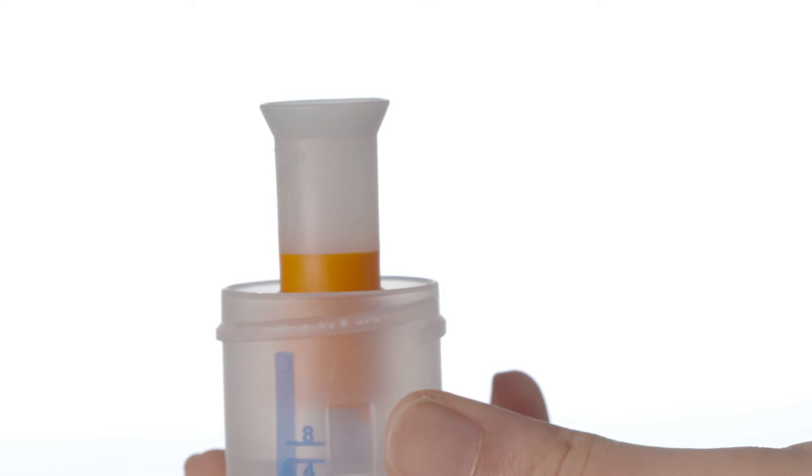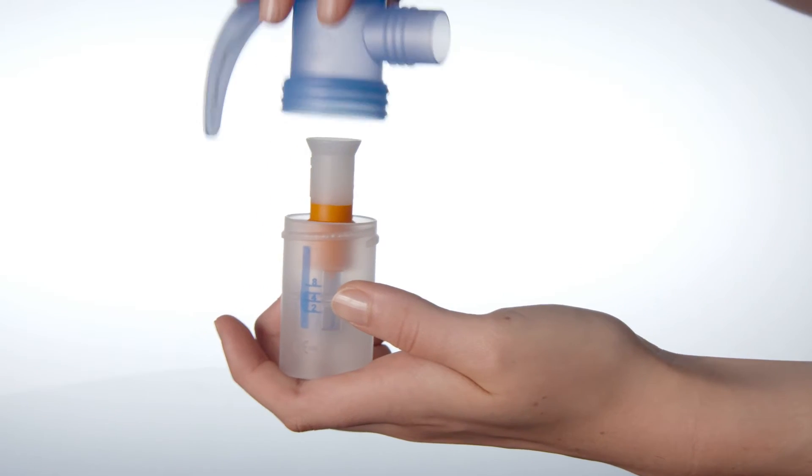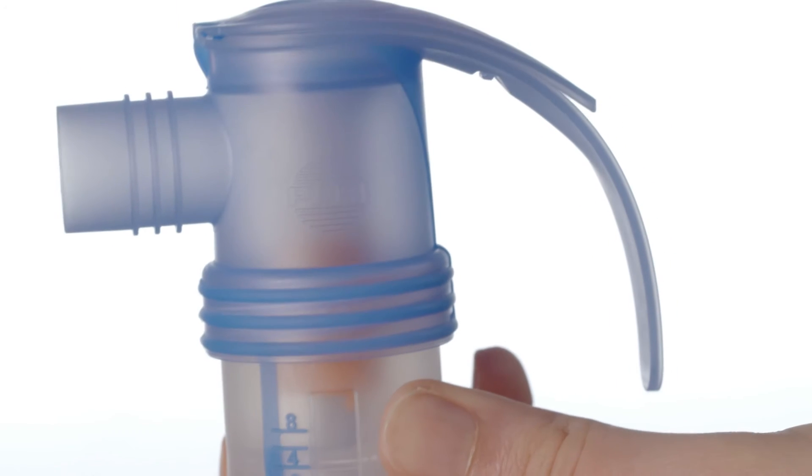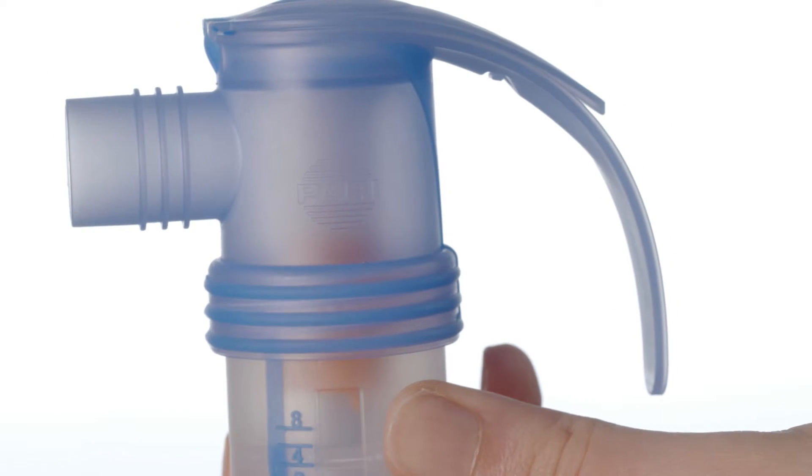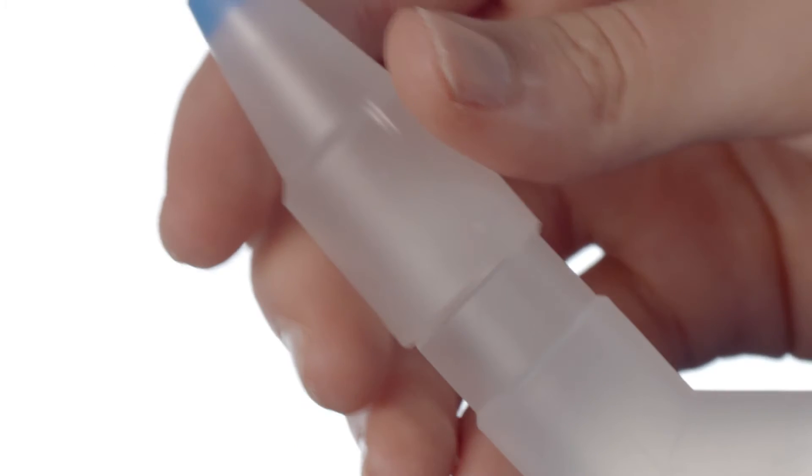To do this, insert the orange nozzle attachment into the lower section of the nebulizer. Place the upper section of the nebulizer on top and firmly close it by turning it in a clockwise direction. Connect the bend and the nasal joining piece.